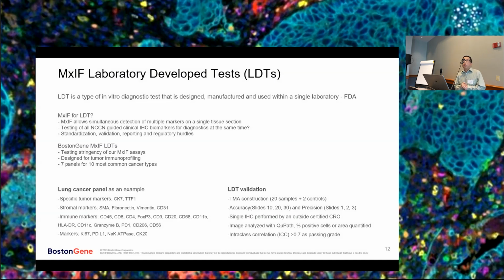So to push the assays, MxiF assays, to the clinics, you kind of need to validate. These are called laboratory developed tests. Per FDA definition, it is a type of in vitro diagnostic test that is designed, manufactured, and used within a single laboratory. So this is us.